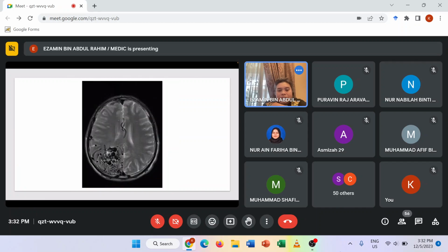Embolize using like this one. This one what we call serpiginous. Dia macam ni. Kalau you nampak macam ni, flowoid pattern, and then like a serpent, banyak beberapa ekor serpent or cacing worm like. So this one is most exclusively AVM, arteriovenous malformation.